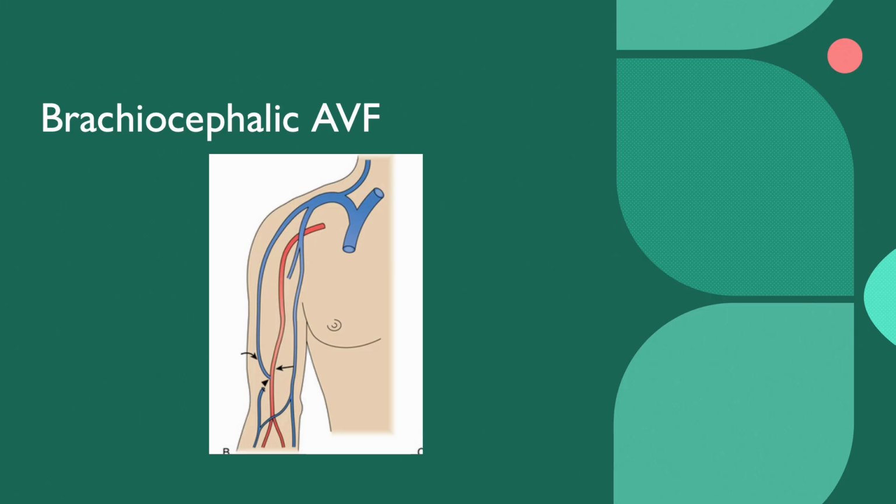And I just want to add, when we do a vein map, which is its own test before a patient gets a fistula, we will go in and we will measure the basilic vein, we will measure the cephalic vein all the way down the arm. The surgeons want it to be at least 0.3 centimeters or bigger. Our surgeons at least want 0.3 centimeters or bigger in order to have a successful surgery.